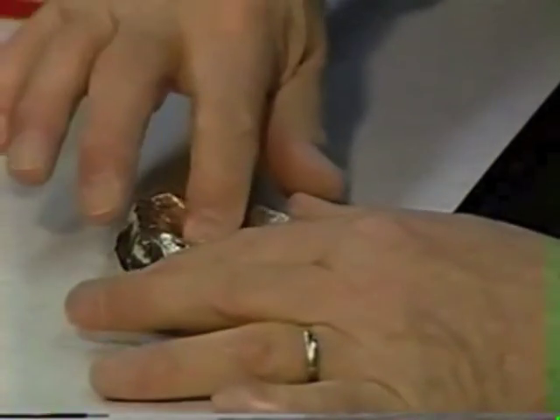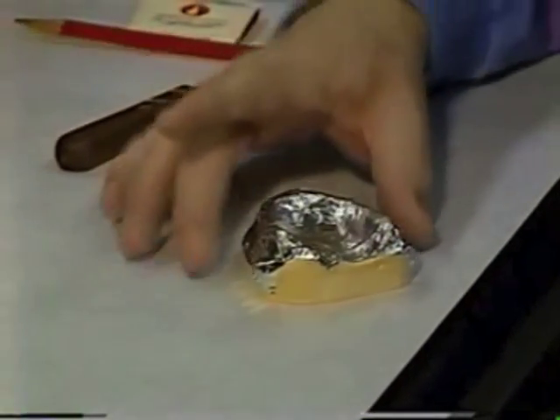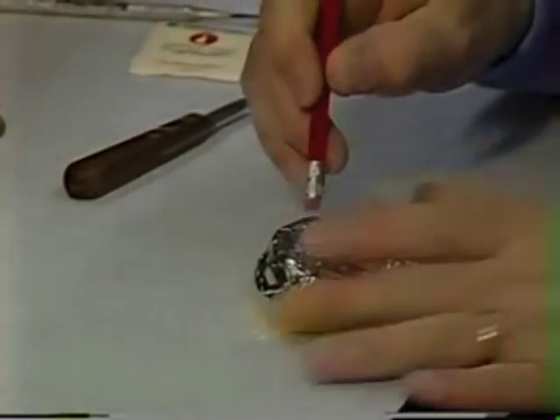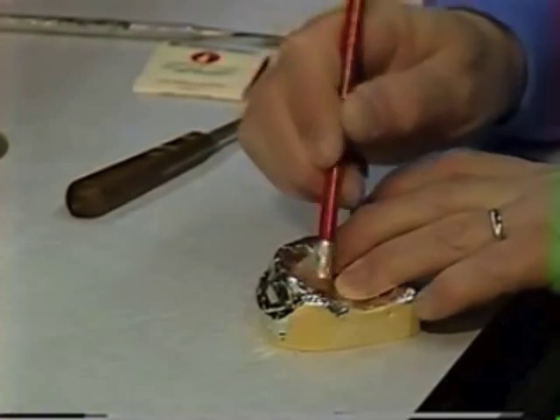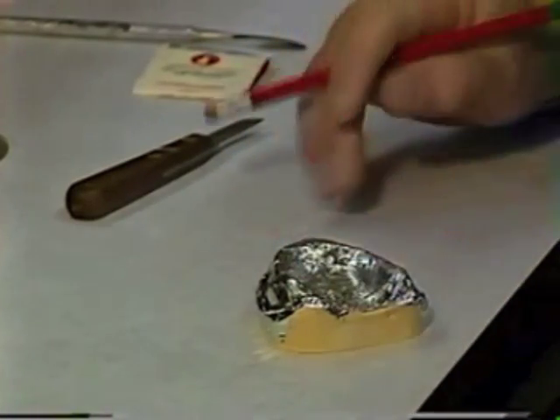You can use the ball of your finger, or you can use a wooden handle knife, or one thing that I use quite often is cotton rolls. Cotton rolls work quite well for burnishing it. If you have a pencil with a very large eraser on it, a pencil eraser works well for burnishing tin foil. You can see that works some of the wrinkles out. Okay, and the smoother you can get this, the better it'll work for you.